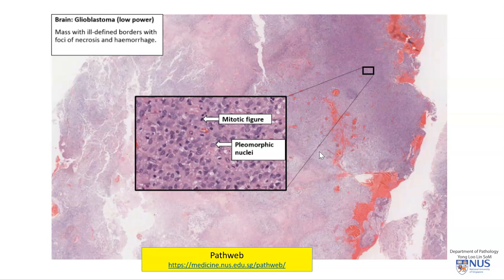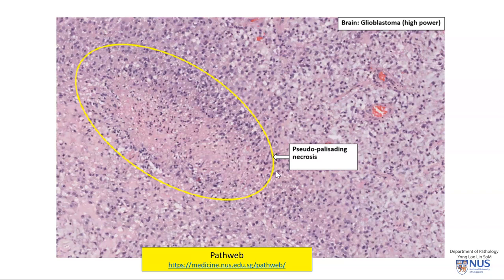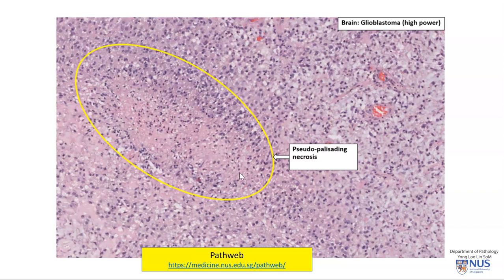Microscopically, glioblastomas show all the features of high-grade tumors. They will be hypercellular with mitotic figures, and the nuclei of the malignant astrocytes will be pleomorphic, with variation in size and shape. These pictures are taken from the Pathweb online pathology resource. There is also a very characteristic feature known as pseudo-palisading necrosis: a central area of necrosis with an amorphous granular appearance and pyknotic nuclei, bordered by a palisading pattern of viable tumor cells. These areas of necrosis are often elongated or serpigenous in shape, bordered by palisades of viable malignant cells.